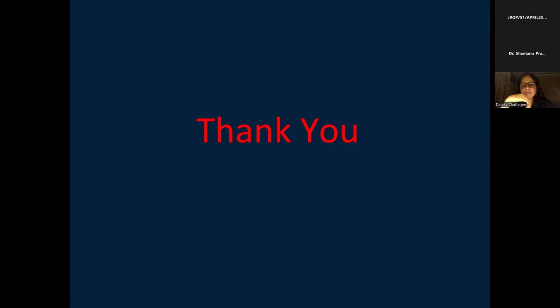Thank you, sir. Thank you, ma'am, for an excellent presentation. You mentioned that while evaluating diastolic dysfunction, we grade them grade 1, grade 2 and grade 3, and we use E by E prime of more than 14 or a TR velocity of more than 2.8 and a LA volume index of more than 34. Can you, ma'am, please explain when we use IVRT or propagation velocity in diastolic dysfunction? Do we use it routinely, or is it just corroborative evidence?